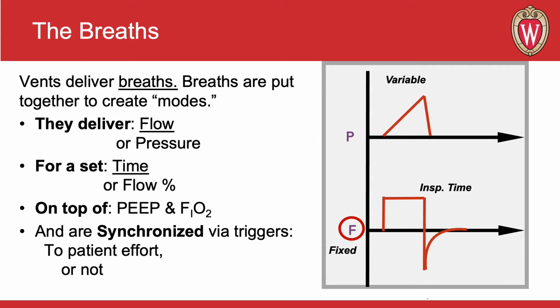So you deliver the fixed flow for a set amount of time, and you do that on top of PEEP and FiO2, which I won't really be talking about much today. That's a topic and discussion for another day. And finally, these breaths can be synchronized to the patient or not. They can march on no matter what the patient's doing. In this case, I've not shown the patient doing anything, so it's not synchronized.